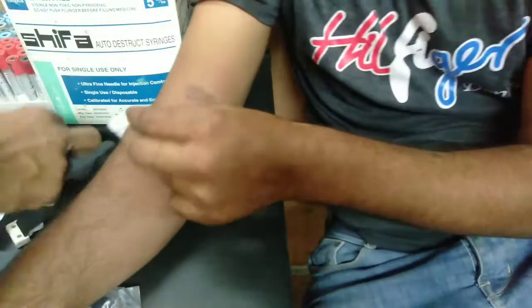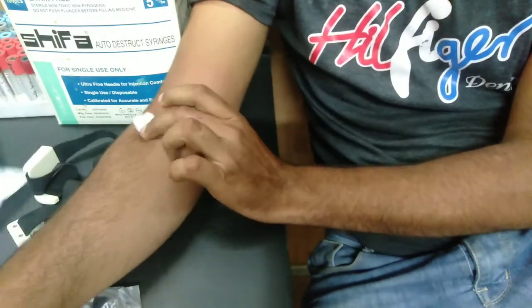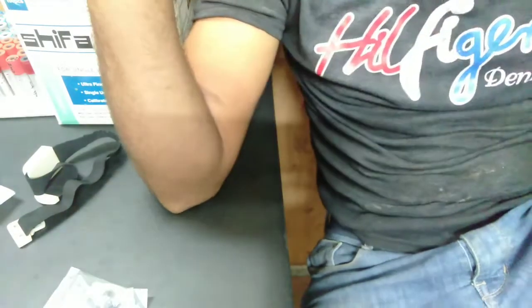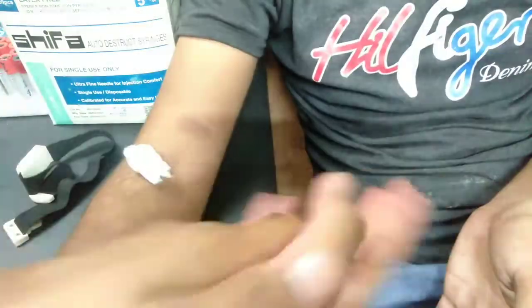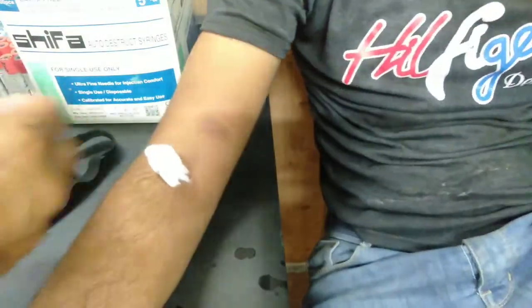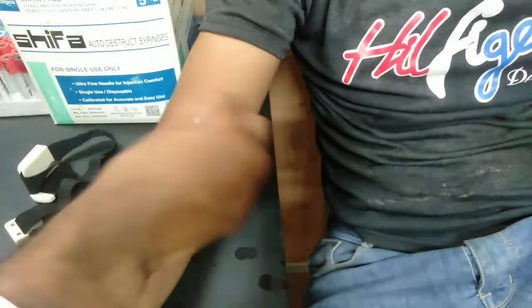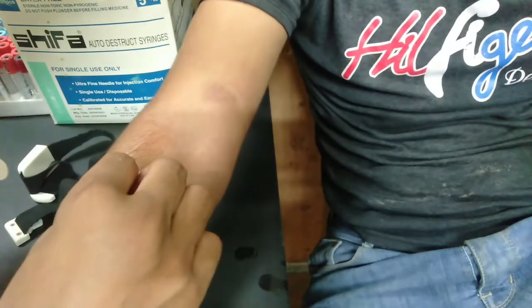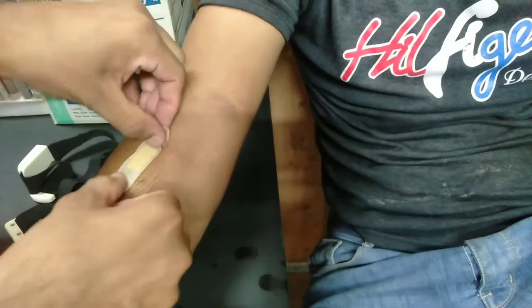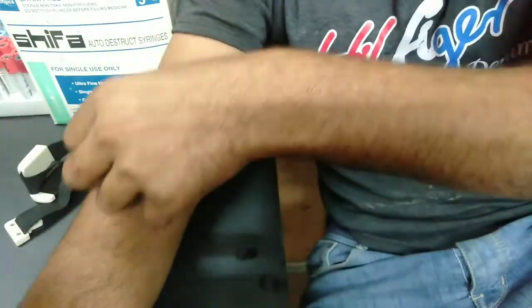After taking the patient's blood, we will send it for testing. We will preserve the patient's blood. After taking the patient's blood, we will wash our hands with sanitizer. We will put a plaster or tape on the site so that the patient's blood loss can be stopped. We will put it here.